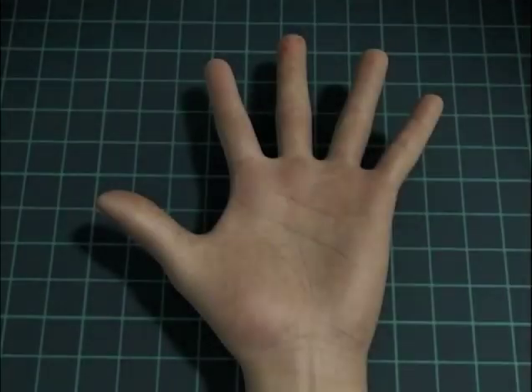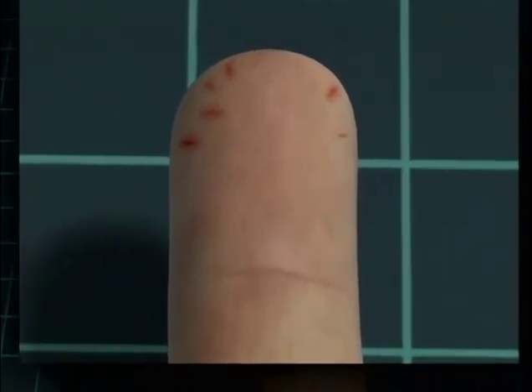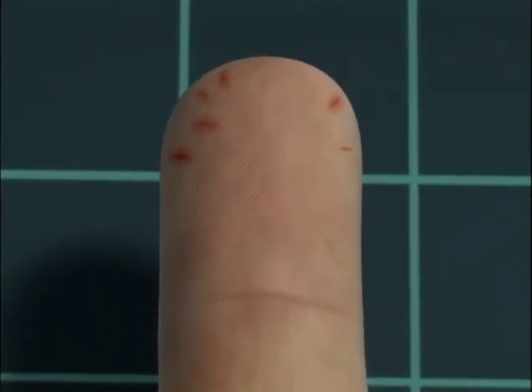For patients 1 year and older, the fleshy pads of the third and fourth fingers are the preferred sites. Because the thumb contains a pulse and its skin can be thick and calloused, it is not a recommended site. Avoid the second or index finger, as it is typically more sensitive than the other fingers and may also be calloused. Punctures to the fifth or pinky finger should not be considered due to the insufficient tissue depth and the potential for injury. Previously punctured sites, as well as sites that appear swollen, infected, or excessively bruised, should be avoided.